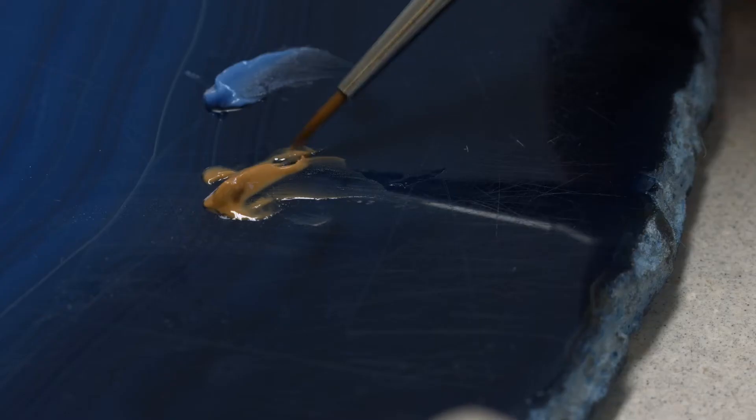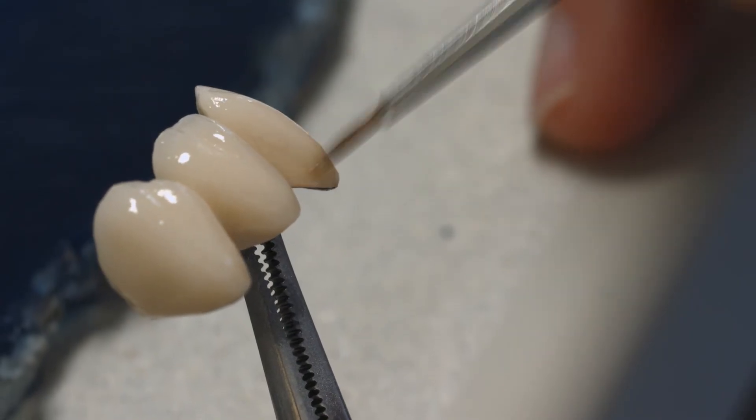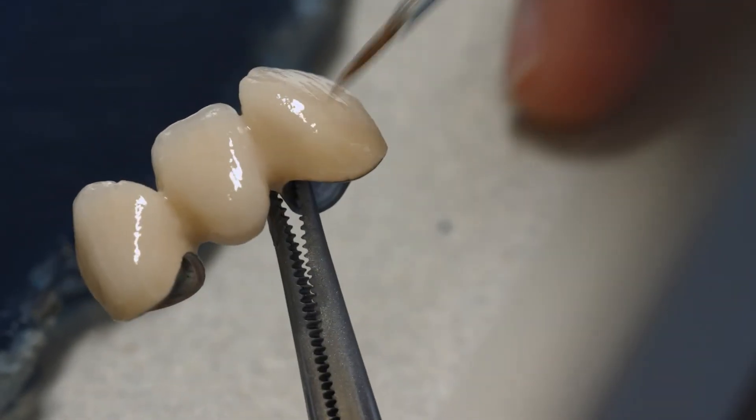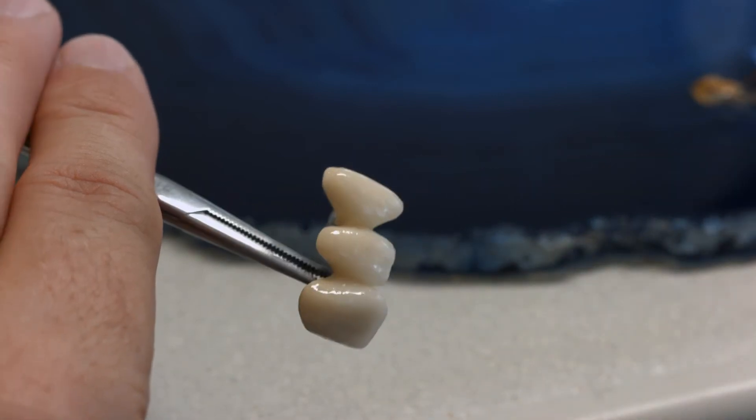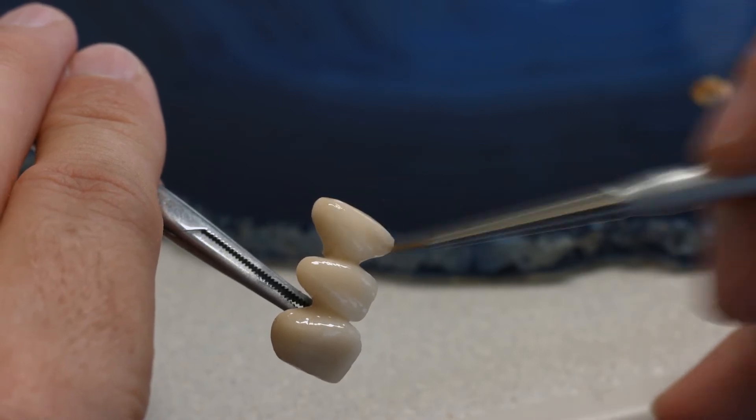Shade adjustments can be made with a suitable amount of the most appropriate IPS Ivocolor shade. Dilute these materials with IPS Ivocolor mixing liquid all round or long life to achieve the desired consistency.